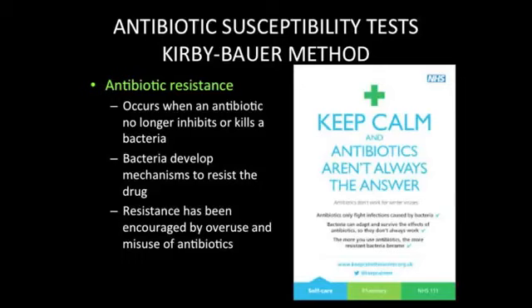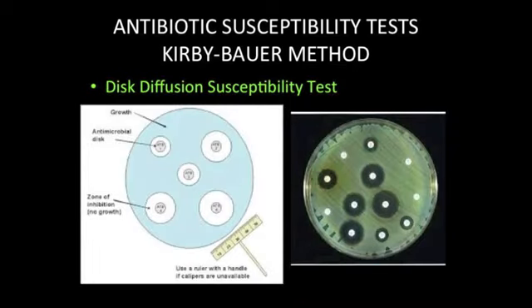It is more important at this time that you understand that the development of resistance has made the selection of an antibiotic to effectively treat an infection more difficult. The development of resistant strains led scientists in the medical community to develop a means of testing susceptibility of bacteria to antibiotics to aid in the identification of an effective drug as early as the 1950s.